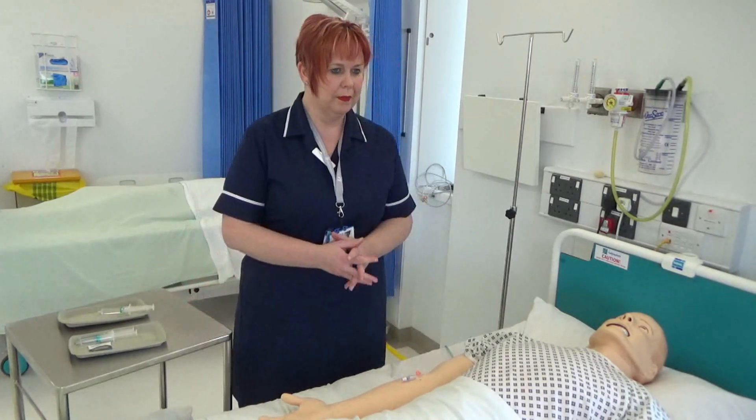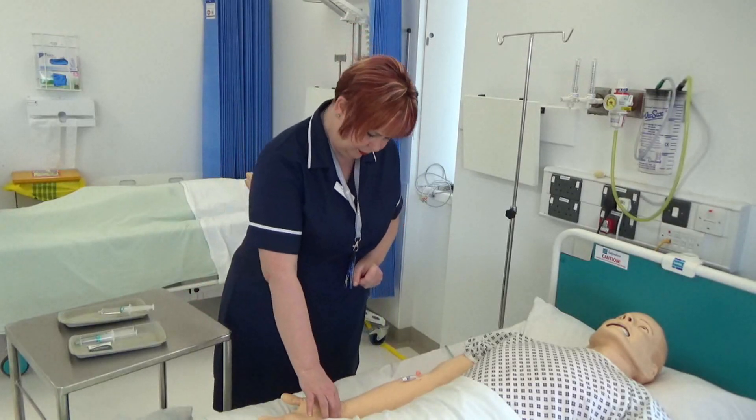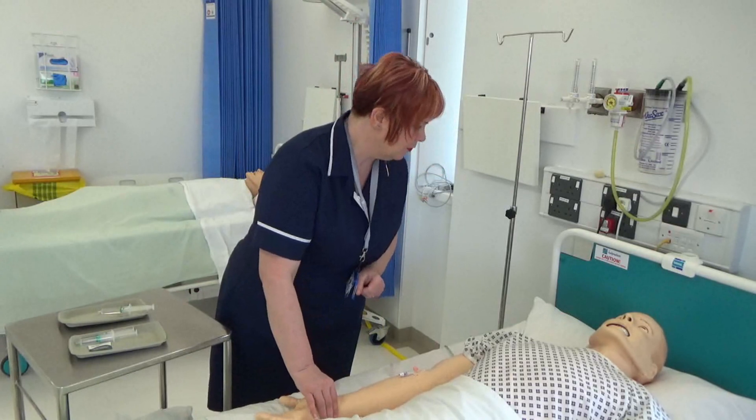Explain and discuss the procedure with the patient and check the patient's ID. This is to ensure the patient understands the procedure and gives consent.